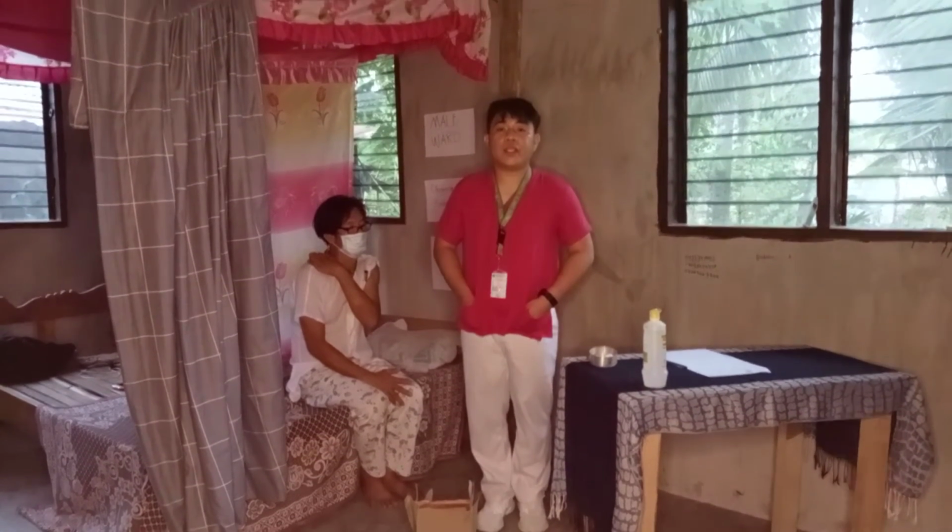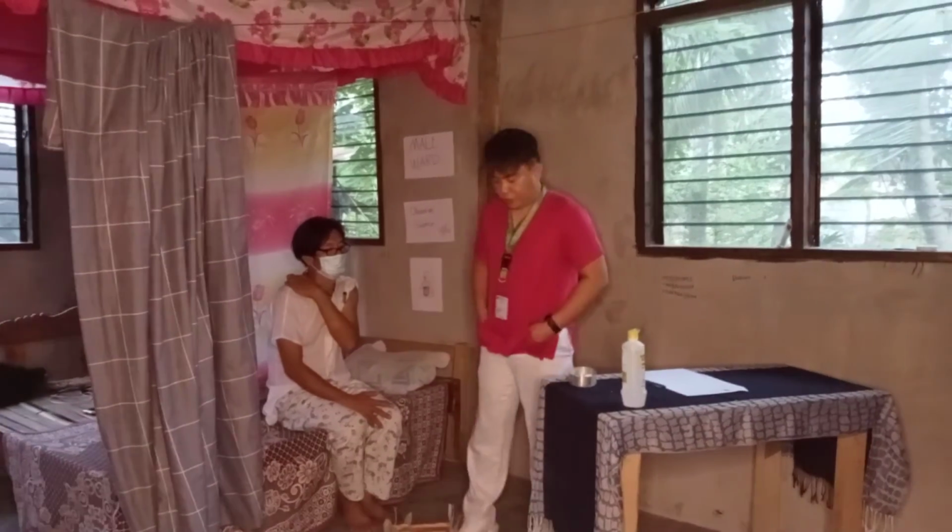Remove the thermometer and wipe with tissue away from the fingers towards the tip, and read the result. Rationale: to prevent cross contamination.